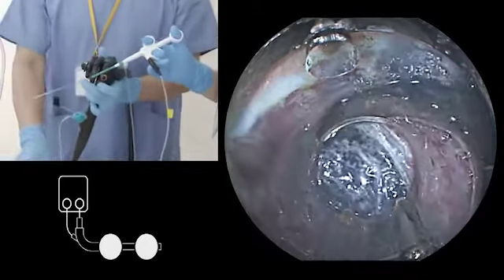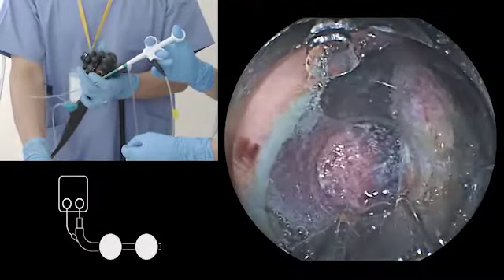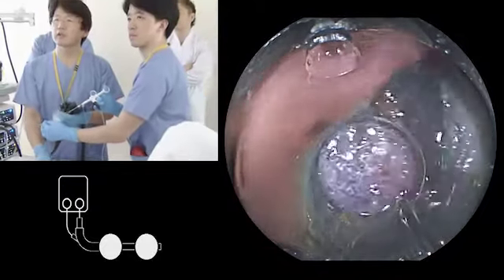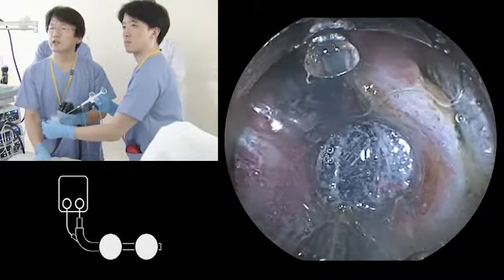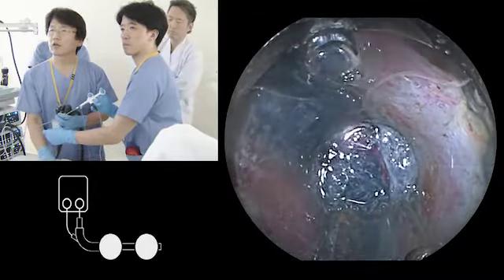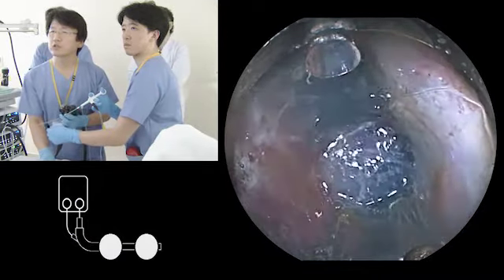Okay, so you have to have a good orientation in your mind of how the colonic muscle is going. But as long as you have that, then you can see the muscle layer directly, and you can select the dissection plane on the muscle layer, leaving a little bit of submucosal tissue.